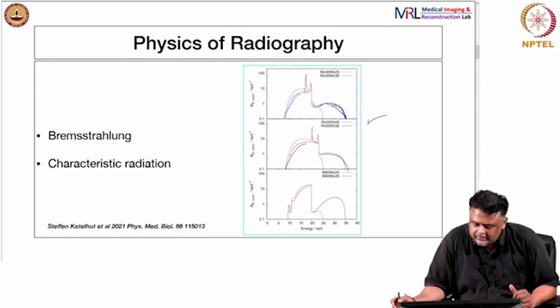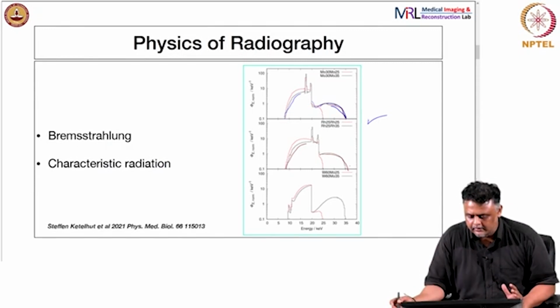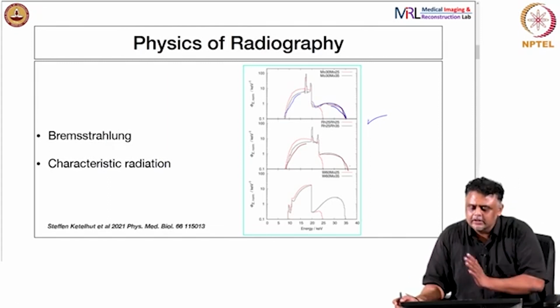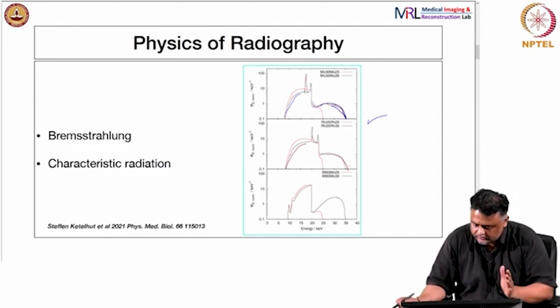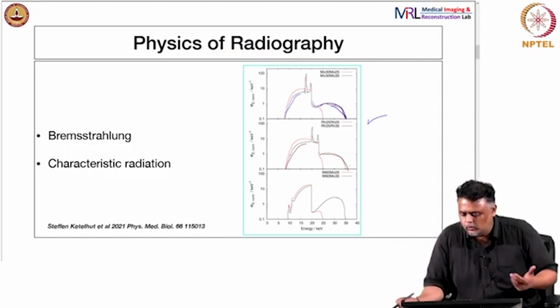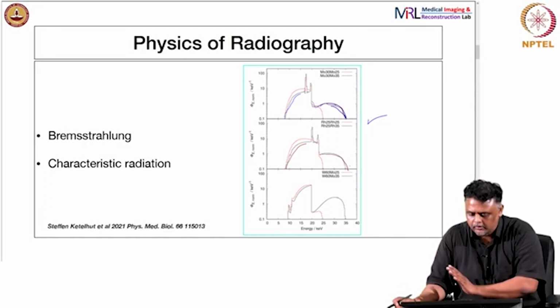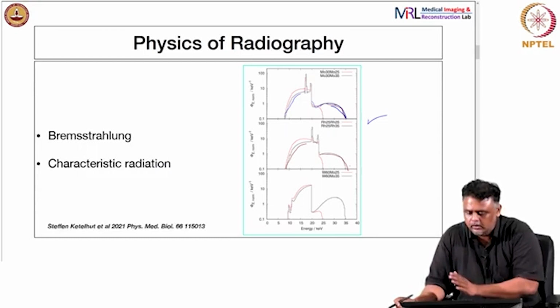They are the continuous emissions. In case you are wondering what the axes are, the y axis you can treat like a number, the number of X-ray photons emitted, and the x axis is the energy. So, it is basically like a histogram of the number of photons emitted in each energy range. You can normalize it so that the area under it is 1, and then you can treat it like a probability distribution of an X-ray photon belonging to a particular energy.